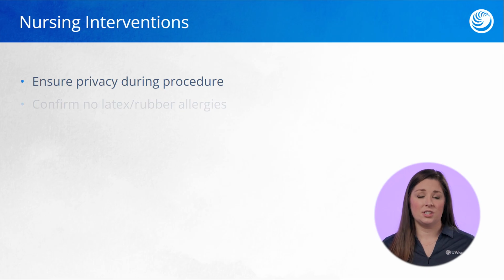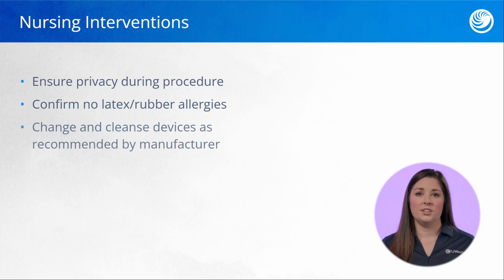The nurse also needs to check or verify if the client has any latex or rubber allergies. Changing and cleaning these external urinary devices is extremely important, and the nurse needs to do this according to manufacturer or hospital guidelines or protocol.